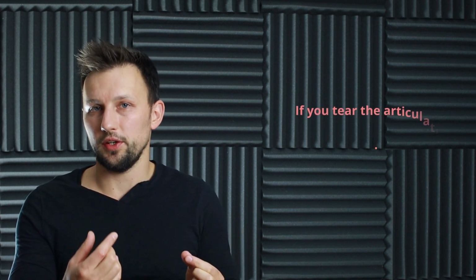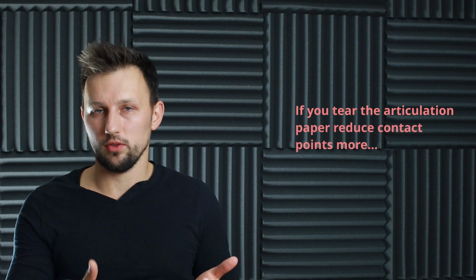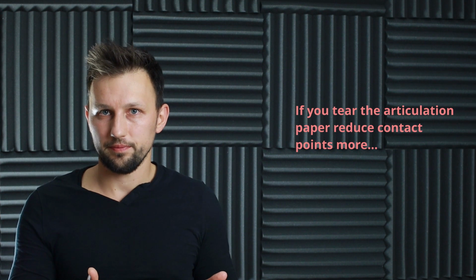And if we tear the articulation paper, that can mean that the contact point is just too strong. So we have to reduce the contact point until the moment when we can remove the articulation paper without tearing it. And I believe that this is one of the most objective ways to check the strength of the contact points.